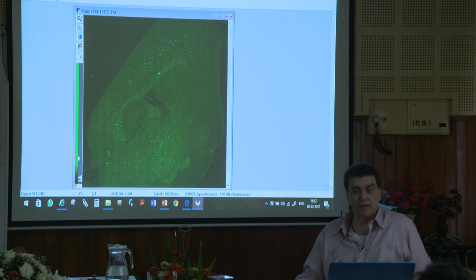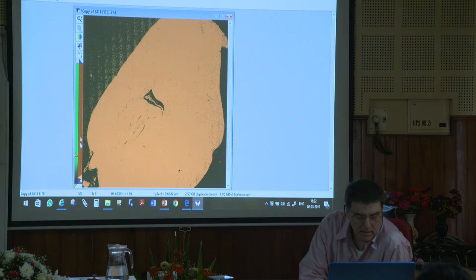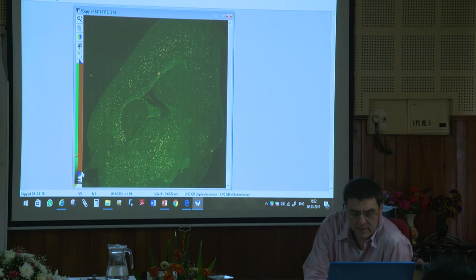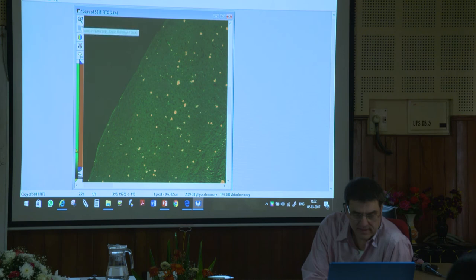But it's a good use, again, of image analysis. These are nice and bright. We did a pretty good job, actually, taking the pictures, from what I remember. So what I could do is highlight what I would consider my plaques, correct? Let's blow this up a little. Take a look. It's a monster image because it's hundreds of images stitched together.